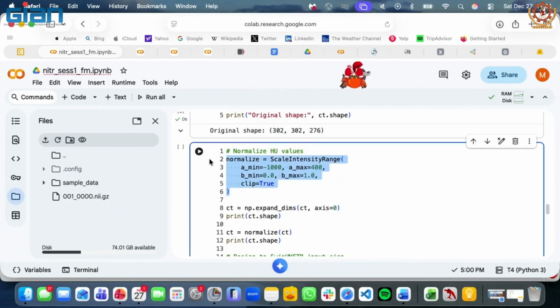Somebody told me about the Hounsfield unit, right? I think you described how the CT is acquired and different organs have different absorption, right? Exactly, I wanted to bring that here. Different organs will have different Hounsfield units. For example, in a CT the bones will be very white and shiny, whereas you can't even see the fluid or blood unless it's contrast enhanced.